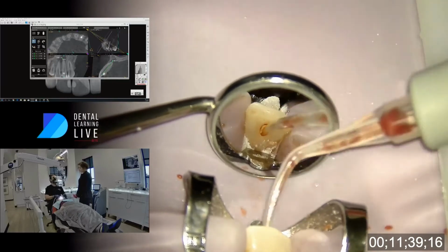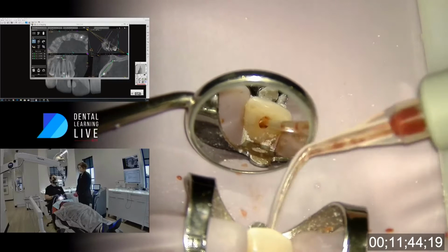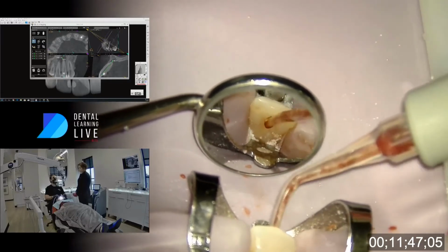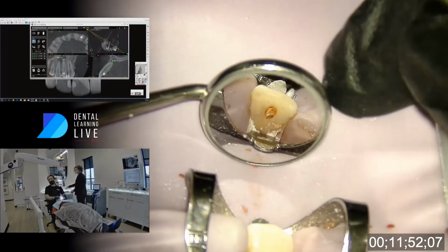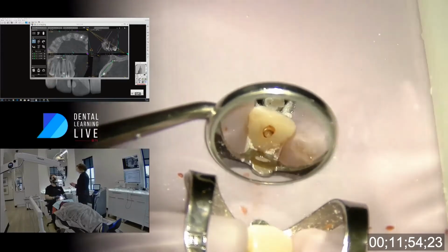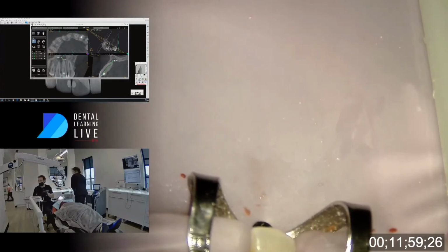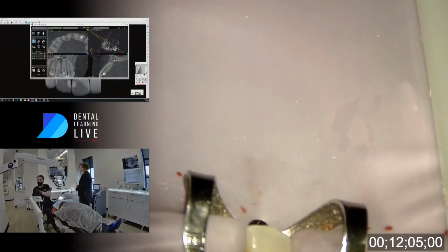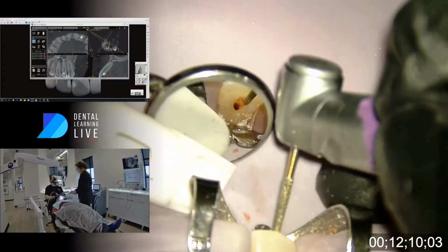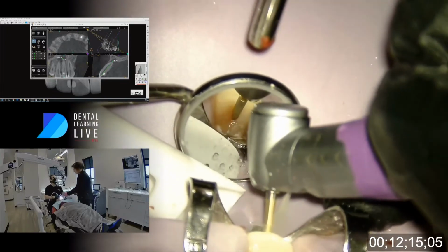Yes, the tooth number is actually number 7. The lucency on the x-ray was around 6 and 7. 6 actually responded to cold, whereas 7 did not. And so we're running with a diagnosis of pulp necrosis and acute apical abscess. And we're just kind of getting through some drainage here. You want to bring up the 2D x-ray?